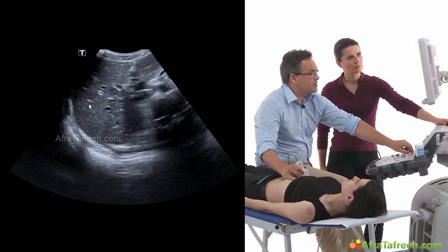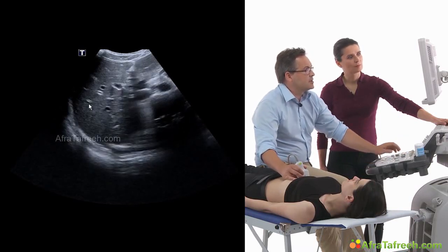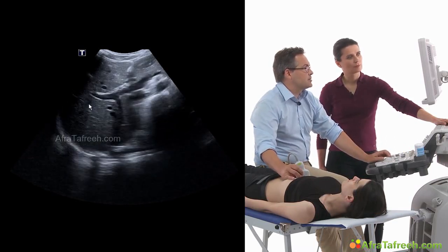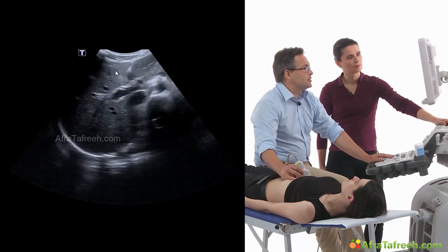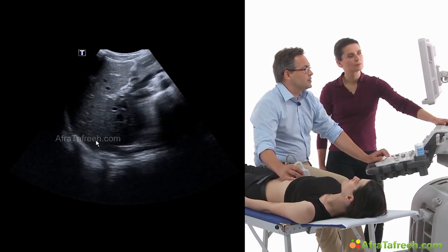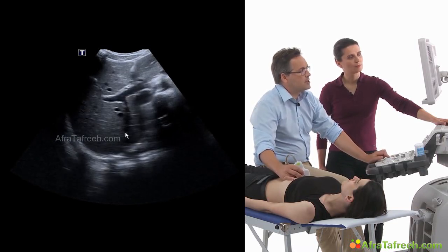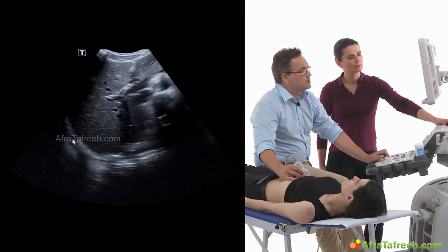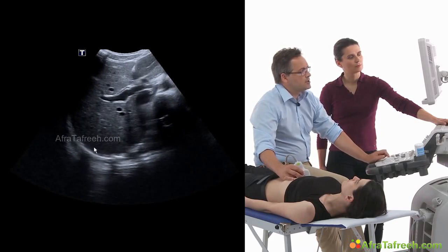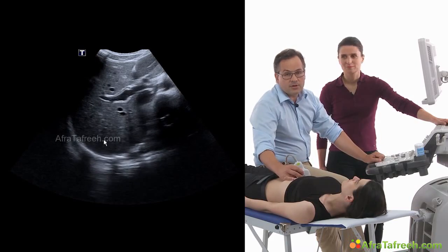And I tried once again to increase the frequency, now using 6.0 megahertz, and the information is getting even better over here. But I think this frequency is too high because I'm not able to display far field regions over here, so I cannot clearly display this far region of the liver.